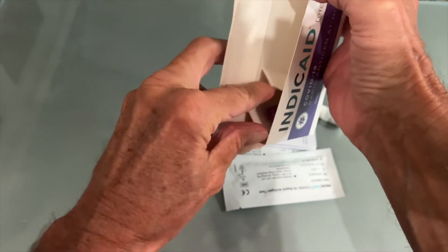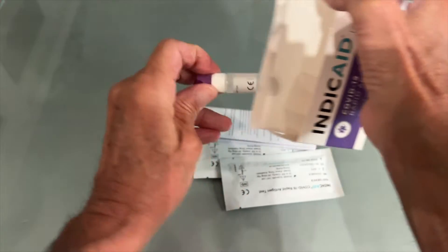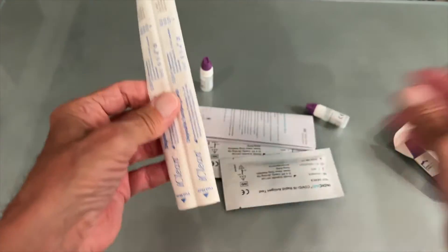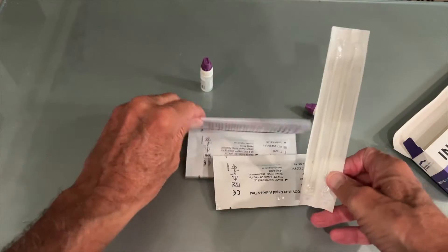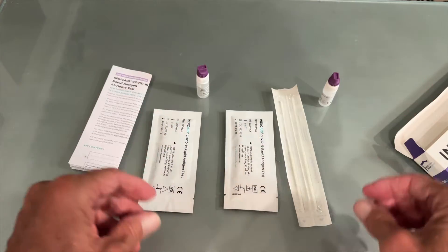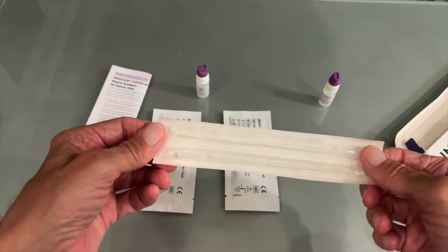There's the solution — gotta get that out of there. All right, we've got swabs. It gives you two swabs and instructions. So I'm pretty sure you've got to swab the inside of your nose five times left, five times right, both nostrils.